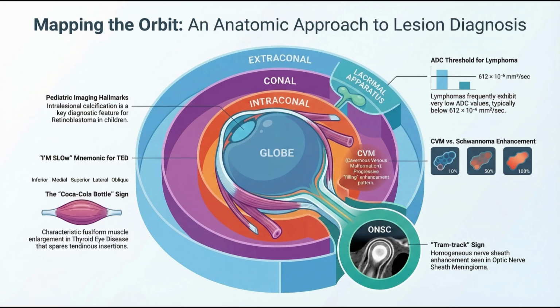Reversible proptosis. And if you have the patient do this heavy lifting breathing maneuver while they are actively inside the CT scanner, the lesion will visibly and dramatically inflate on the scan. The source shows a clear example where a lesion went from about half an inch to over an inch in diameter just by having the patient hold their breath and bear down. That's wild. It is a dynamic physical stress test that confirms the diagnosis right there on the screen.